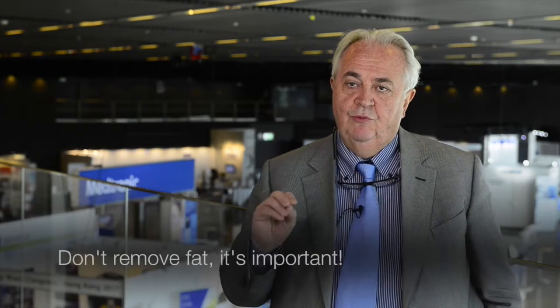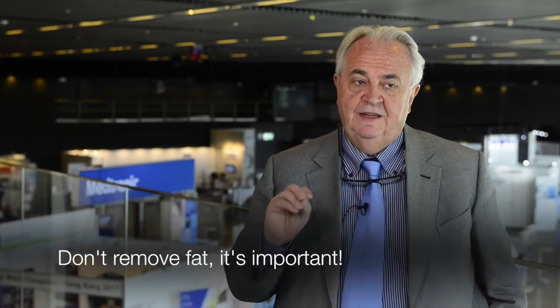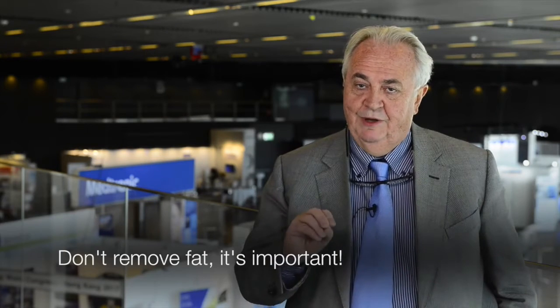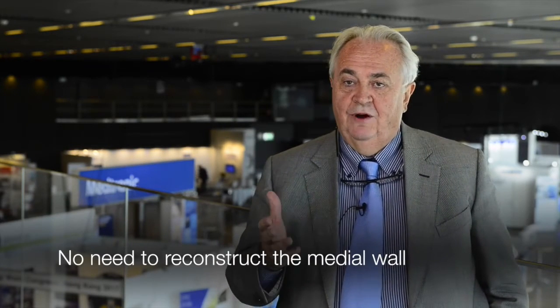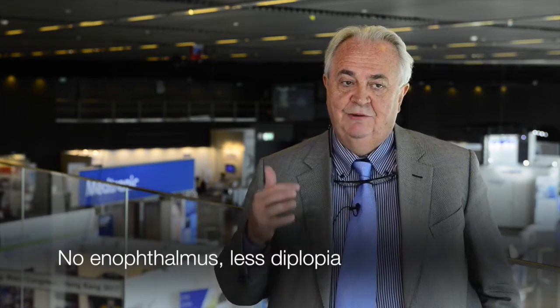In this surgery, the amazing thing is that we always try not to remove the fat. The fat is really important for the orbit. If we preserve the fat, we don't need to make a medial wall orbital reconstruction. And we avoid enophthalmos, and we have a much lower rate of diplopia post-op.